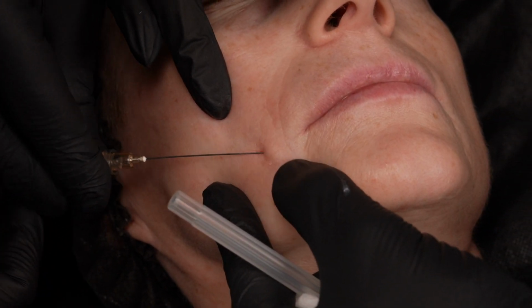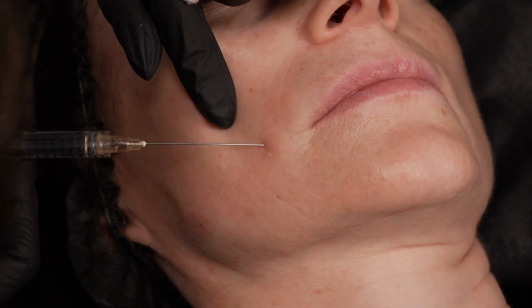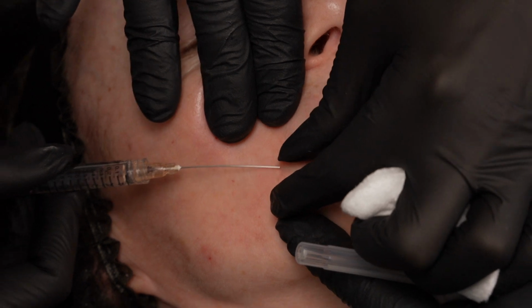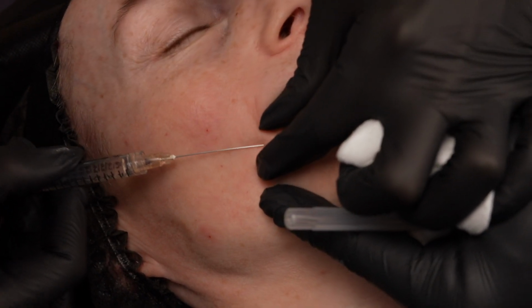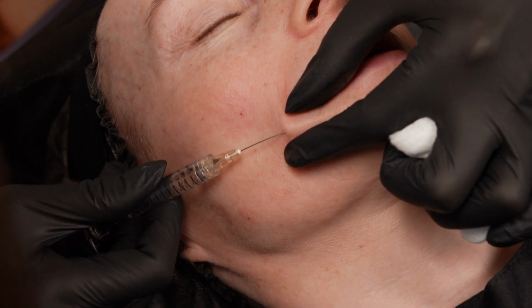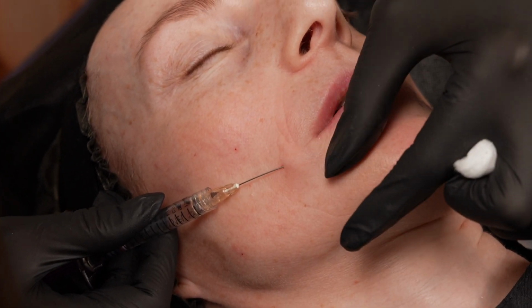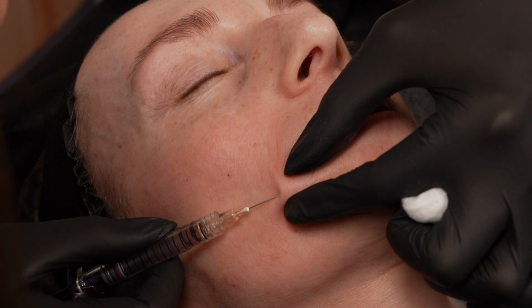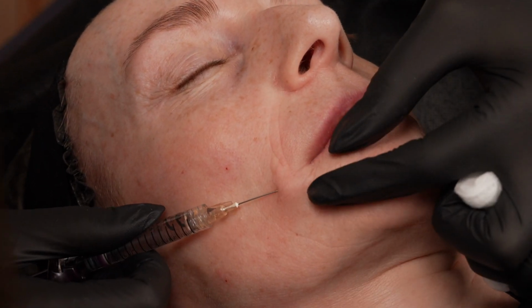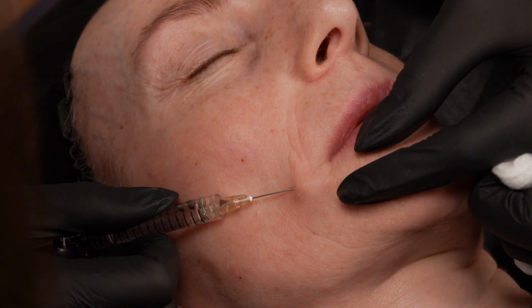Stay superficial. Okay? You can stretch. I can help. Your favorite product, you said, is? Ultra 4, 2. His favorite product is 2 and 4, and my favorite is 2, 4. I use 4 the most. I know that you use Ultradeep.